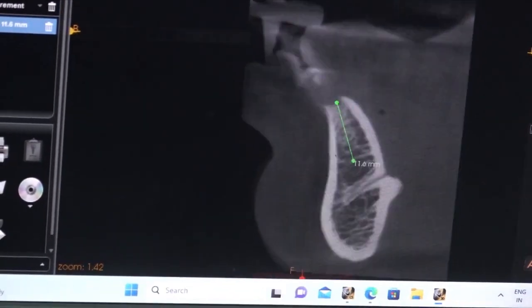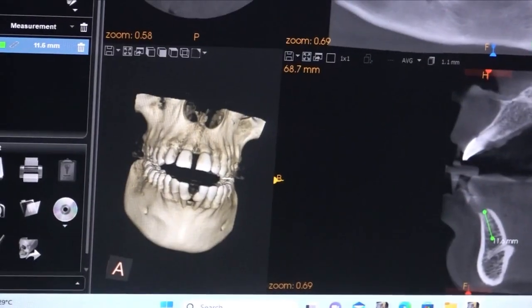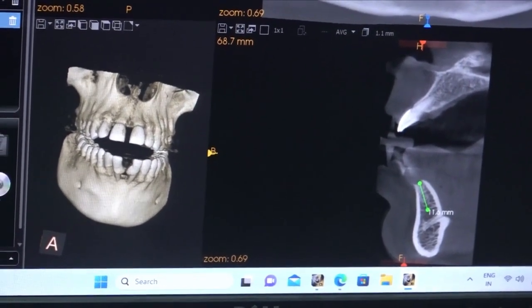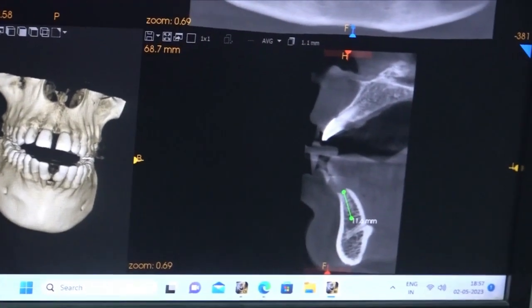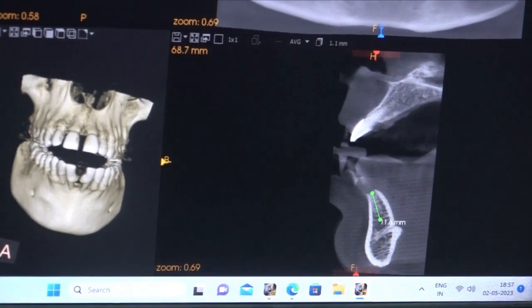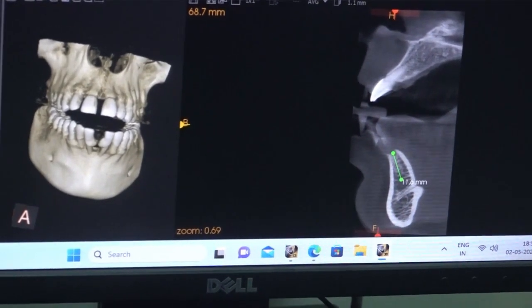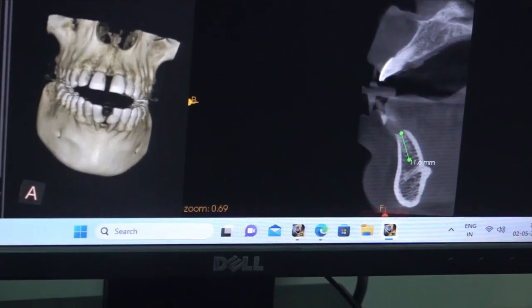Placing a short implant in the midline has another advantage. What is another advantage, apart from safety to the vessel? Stability will be more in smaller implants. The force will be better distributed. If you select a short implant, that is an advantage in one aspect. One is avoiding the lingual vessel. Okay, you should read articles about the lingual vessel. There are some good articles about it.